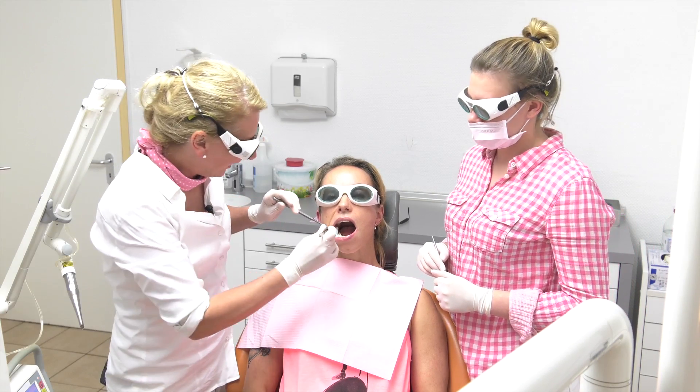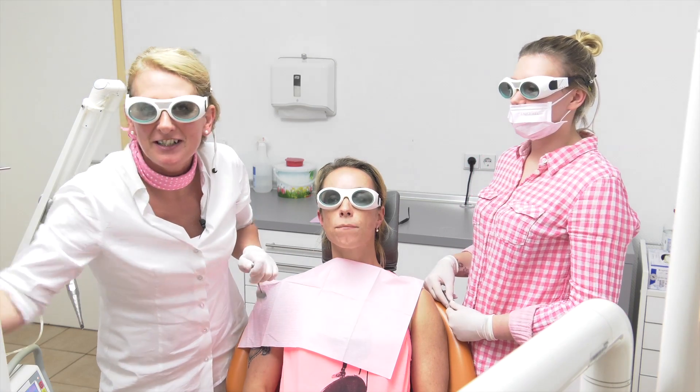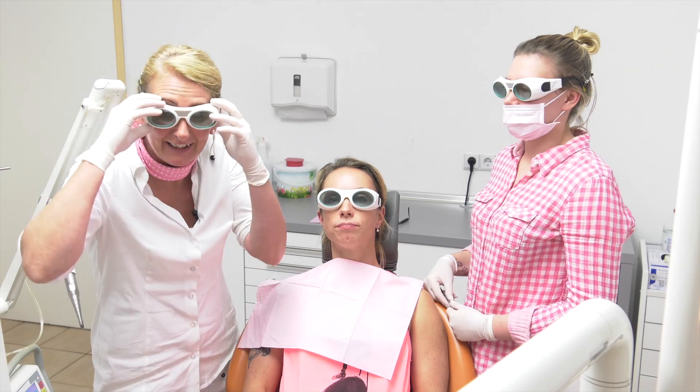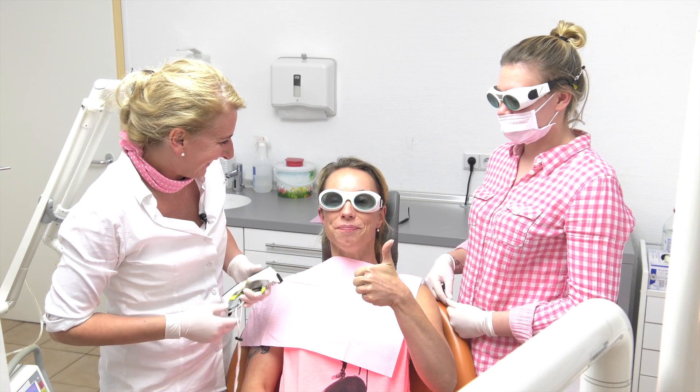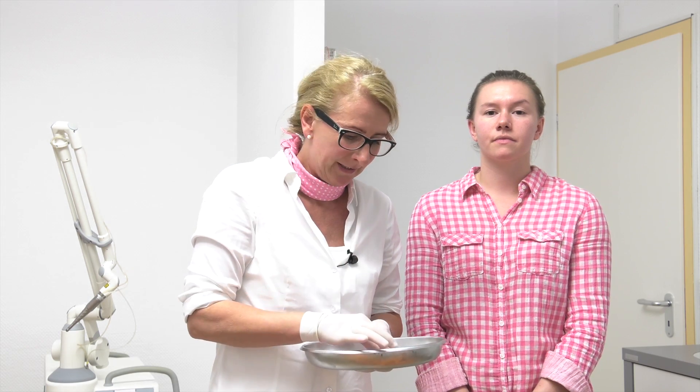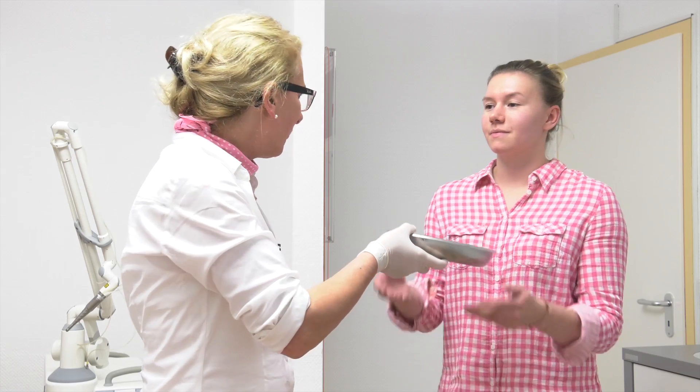I'm very interested how our patient feels. Let us ask Ellie how she feels. It's fine, thank you. So that you are able to compare these two different treatments, my medical assistant will show you it on the tooth model, and she will use the ordinary phosphoric acid. So, Frau Ubele, enjoy it.